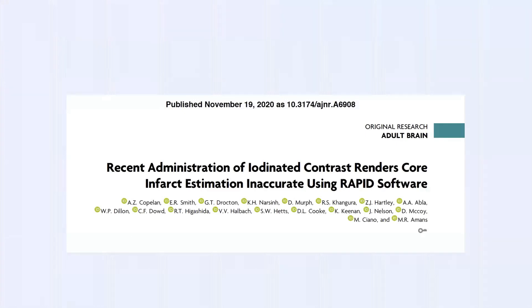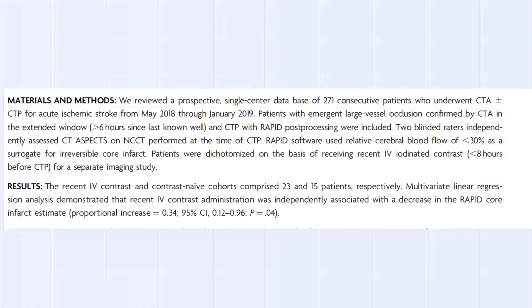Why didn't we see this on CT perfusion? A UCSF group published in 2020 suggesting that recent administration of iodinated contrast — such as at a spoke hospital before transfer — renders core infarct estimation inaccurate using perfusion software. Their case is nearly identical: right MCA abnormal ASPECTS, right MCA occlusion, CT perfusion shows zero core infarct, yet MRI confirms the right MCA infarct.